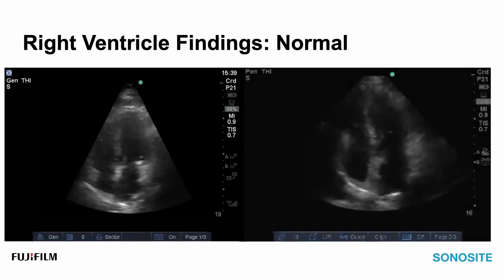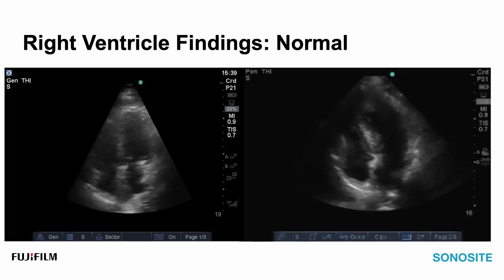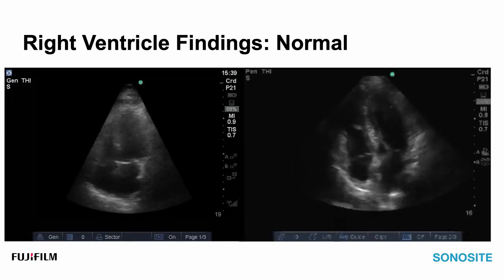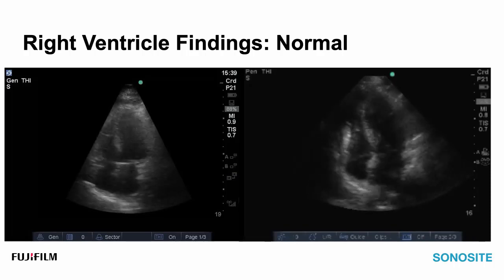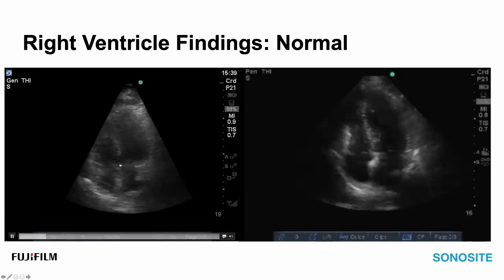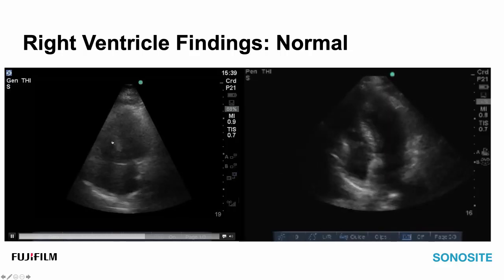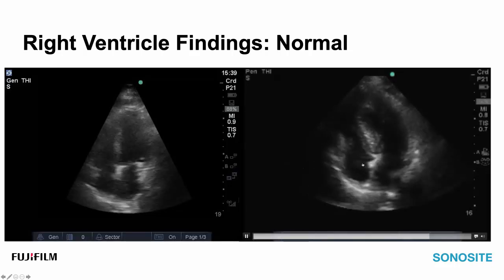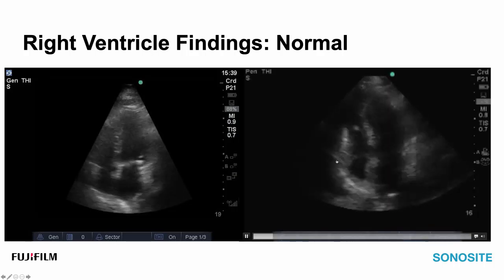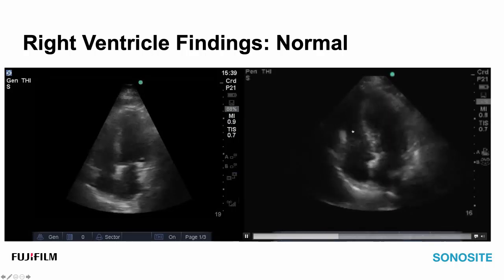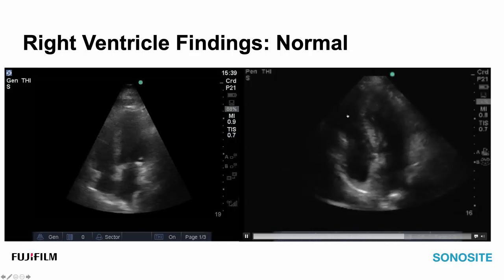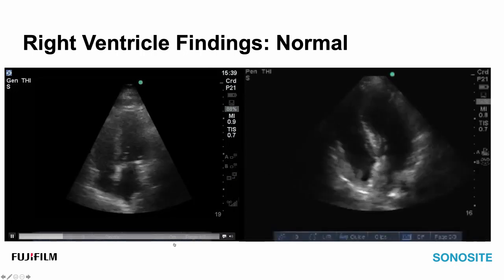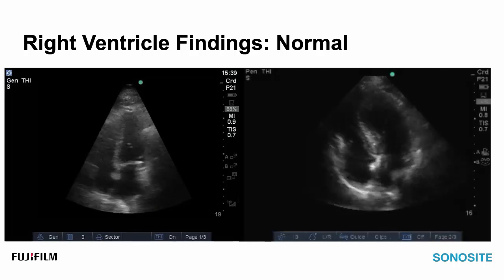Let's look at a couple of normal right ventricles from the apical four-chamber view, which is favored for assessment of the right ventricle and allows easy size comparison to the left ventricle. The shape of the right ventricle is triangular, and I think of it as a companion chamber to the left ventricle that doesn't make itself known unless there are real problems. In these two images you can see the RV is a sidecar alongside the left ventricle, showing nice systolic movement — generally a movement of the tricuspid annulus towards its own apex — representing normal size and function.